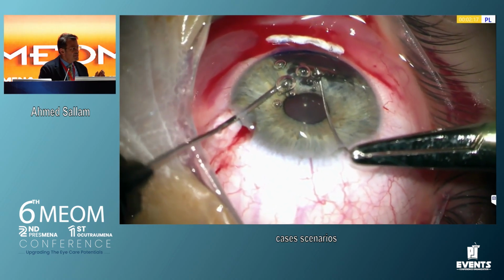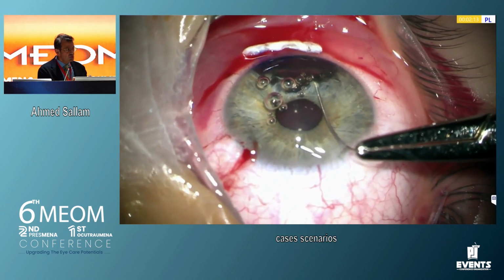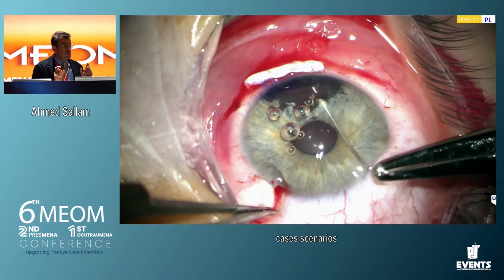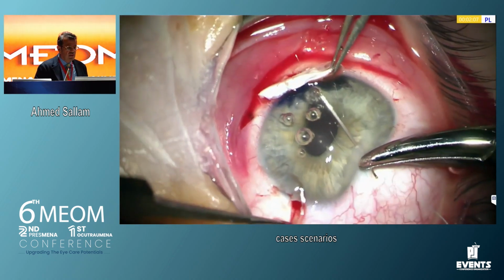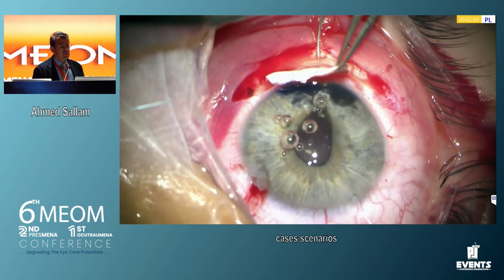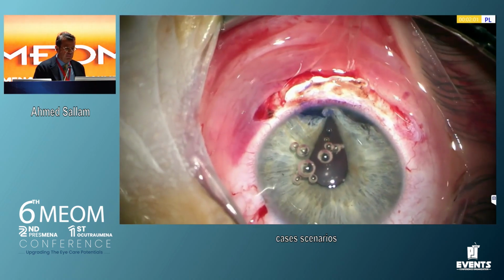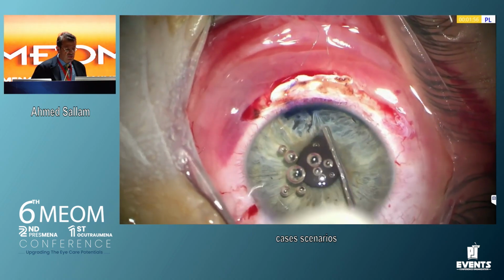And when the dialysis is big, something I've learned is to try to do more sutures, because if you don't do enough sutures, you'll not be closing enough. And I encountered that with another case. So here we did 3 sutures, 1 in the middle and then 2 on each side and out under the flap. And these are Prolene sutures. And I also do it with Gore-Tex sutures now.